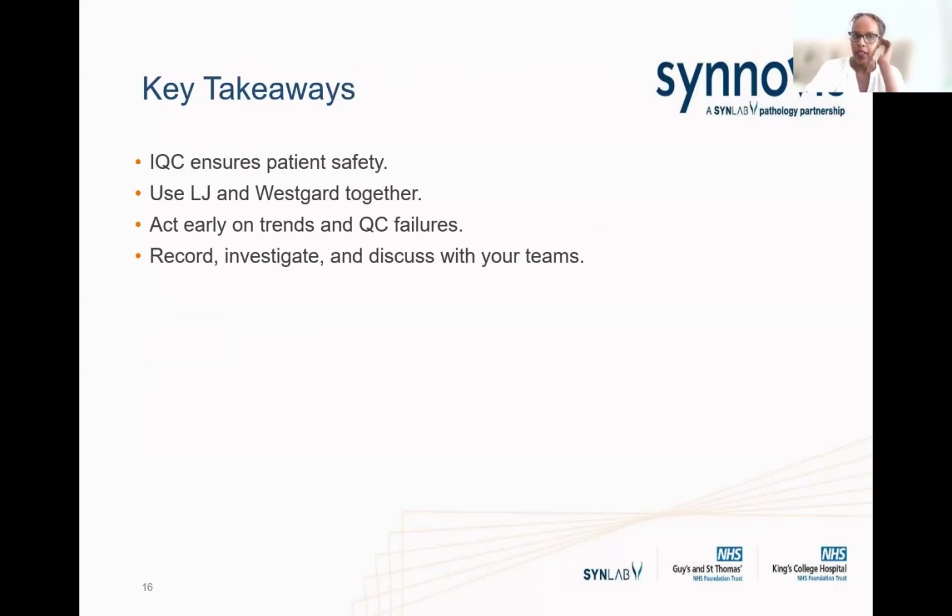So if you just look at the key takeaways then, IQCs: we need IQC in everything we do because it ensures patient safety. So we need to make sure there are ways, whether it's a material we're using or other ways of running QCs, that the assay is in control before you run patient samples. And there is a review that data is correct before you run any patient sample or report.